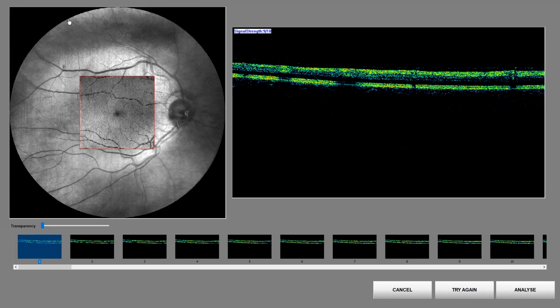As we can see here, there are no interruptions, which means that the patient hasn't blinked, hasn't moved the eye. Here we have horizontal 256 scans and the same at vertical level. So we are going to have about 65,000 spots in this area.